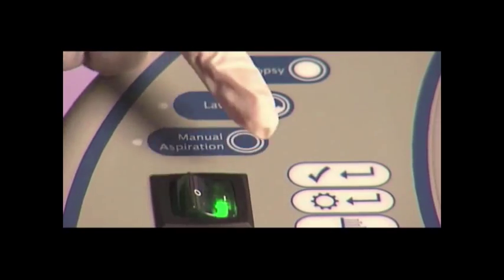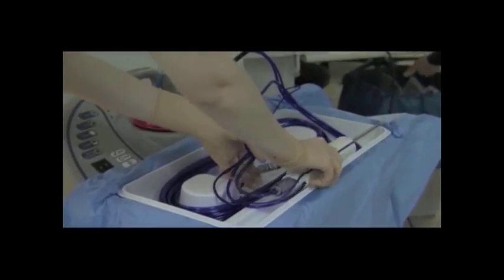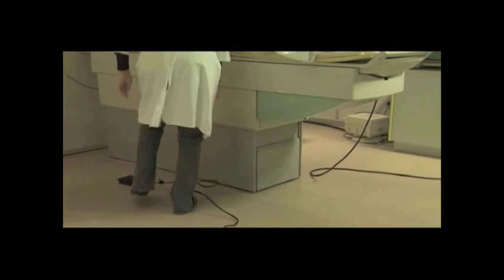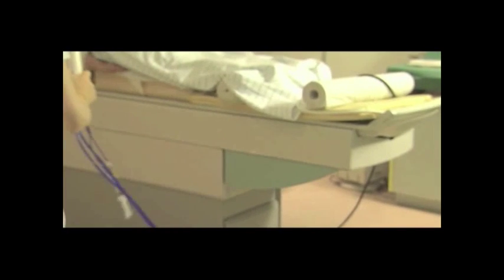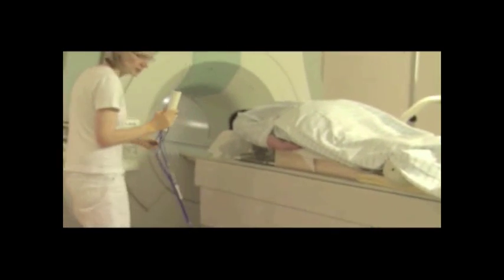Turn the ATEC console on and take the MRI-compatible handpiece and foot switch into the MRI suite. The ATEC MRI handpiece is equipped with 20-foot tubing to allow the physician to easily perform the biopsy while maintaining patient safety with the console located just outside of the MRI suite.